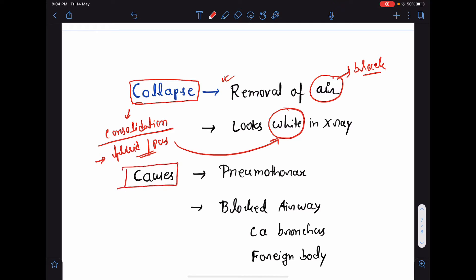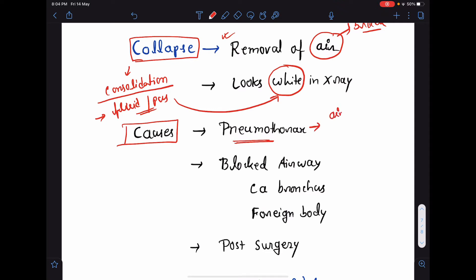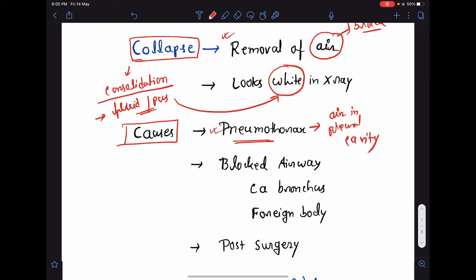So, we will have to learn how to differentiate between consolidation and collapse from a chest x-ray. Now, what are the common causes of lung collapse? The most common cause of lung collapse is a pneumothorax. Pneumothorax means there is presence of air in the pleural cavity. Air in the pleural cavity means pneumothorax. We will learn the findings of pneumothorax in a chest x-ray in my following class.